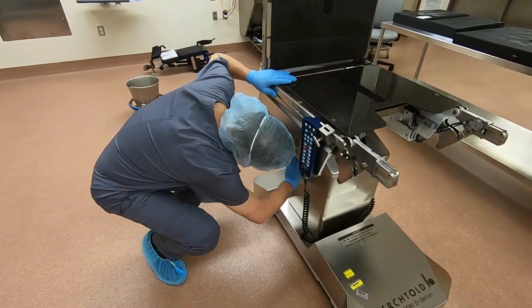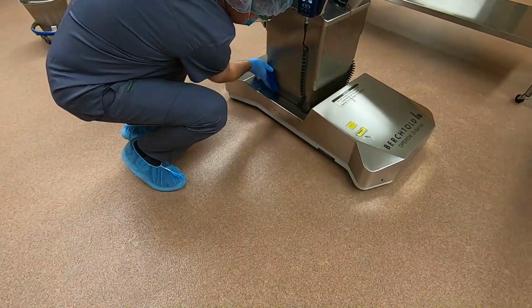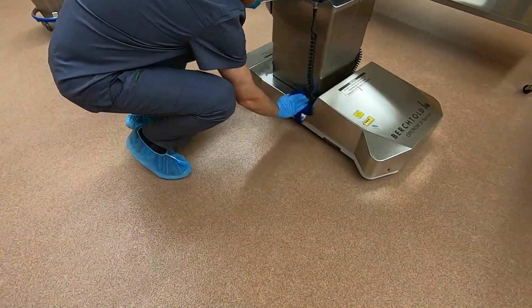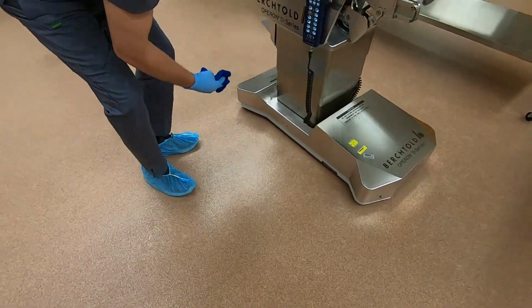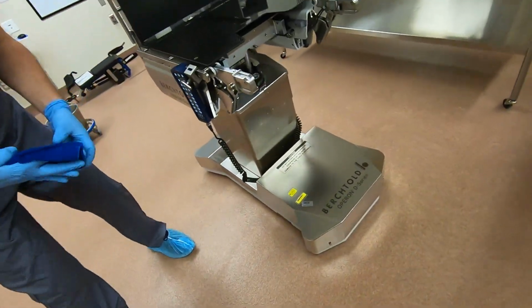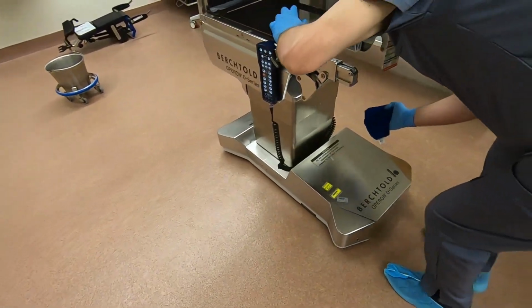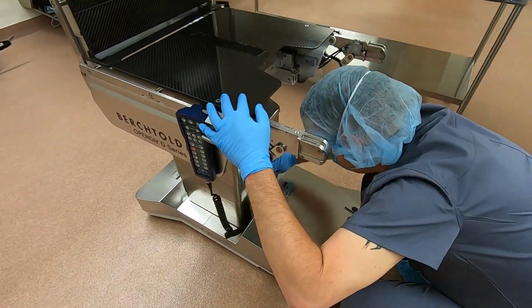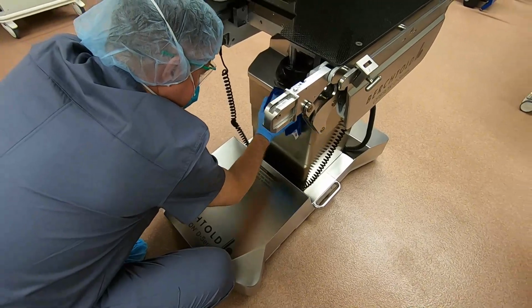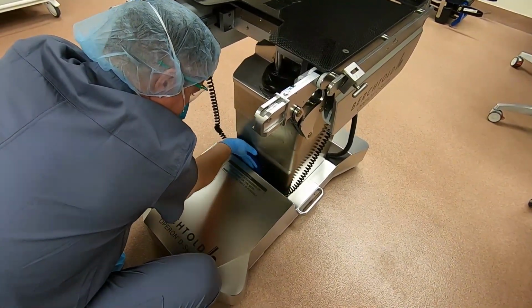Clean, fresh surface. Continue cleaning from top to bottom with an S-stroke motion, ensuring that all areas are wiped, cleaned, and disinfected. Ensuring that no areas are missed, continue to move in a clockwise or counterclockwise format. Continuing from top to bottom, wiping in an S-stroke motion with the leading edge of the wipe, ensuring all areas are wiped and none is missed.